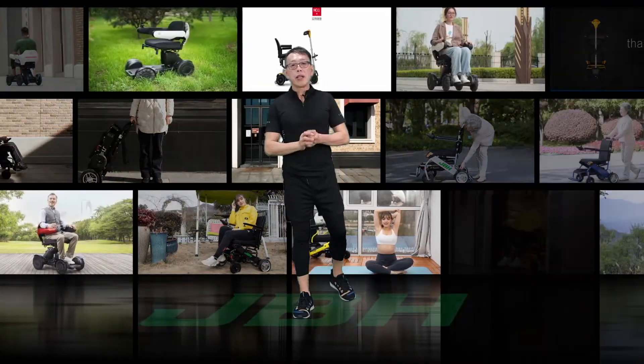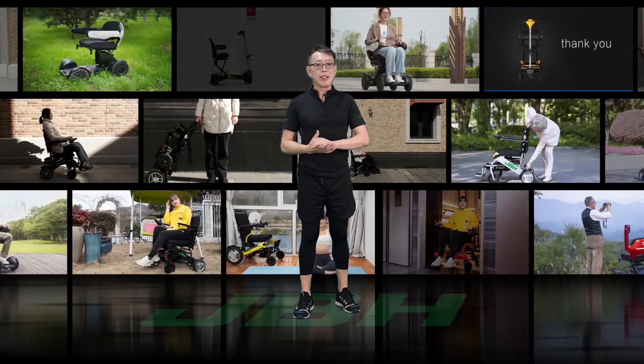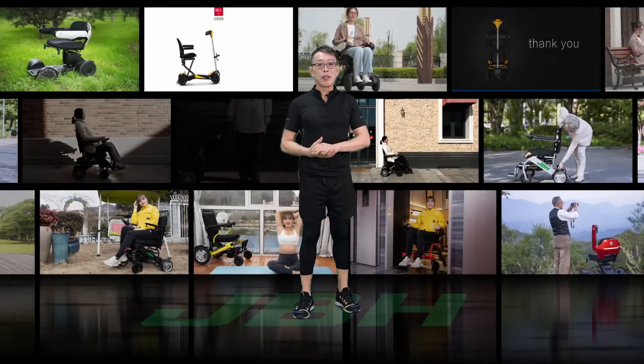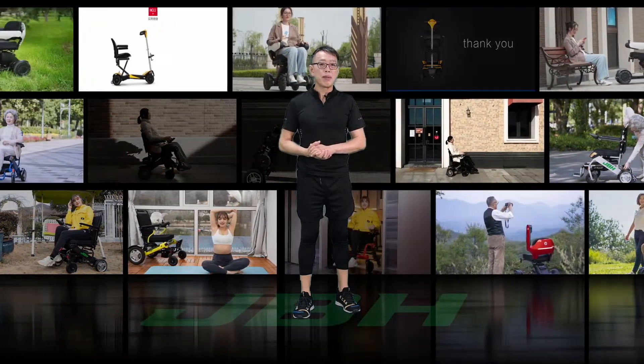Hello, this is Kevin from JBH. Today, I'm very glad to introduce you how to open the box and do the initial setup of the JBH wheelchair. Thank you very much for choosing JBH wheelchair.